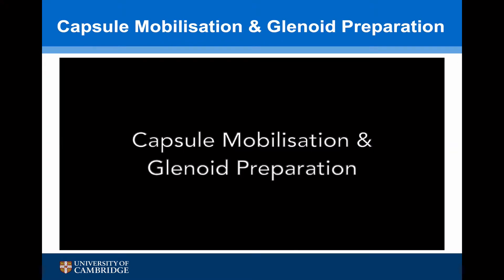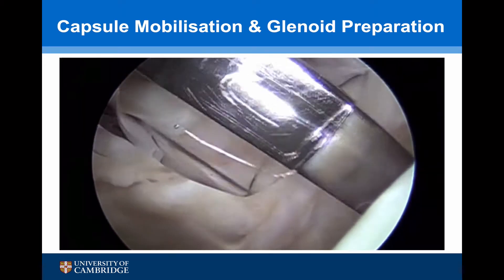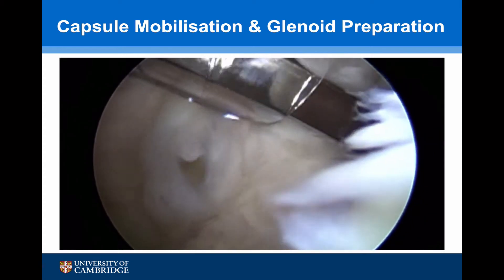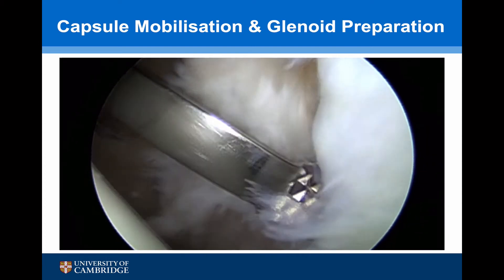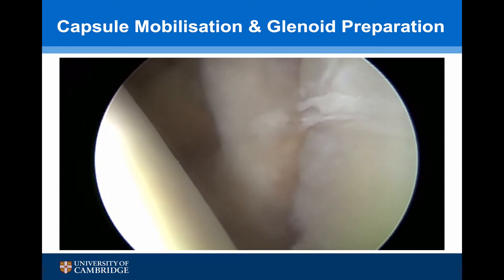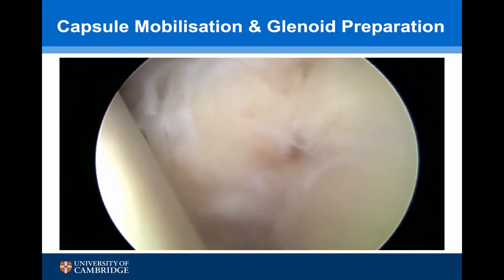This is the capsule labrum being mobilised in the patient we've already seen. I'm using a knife rasp, which has a nice sharp edge, starting at about the two o'clock position and carefully making sure the rasp stays on the glenoid, cutting the capsule from superior to inferior. I like to make small steps — there will be a tipping point where the capsule is nicely mobilised — making sure that the liberator is quite medial, pulling back and pulling the capsule with the bony Bankart away. It's important to get right down to the six o'clock position. As we progress, we can see the fibres of subscapularis as the capsule has floated up into the reduced position. We switch the inflow off and the water leaves the joint; we can see the capsule actually sucks itself up into the joint.